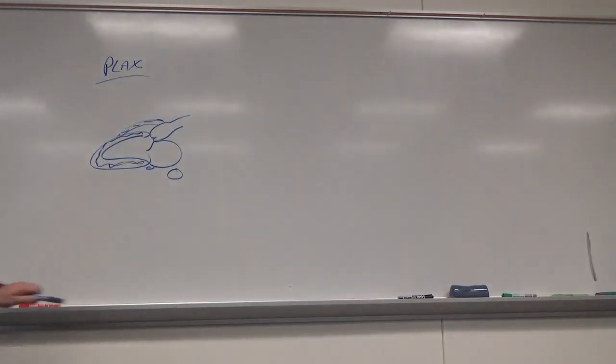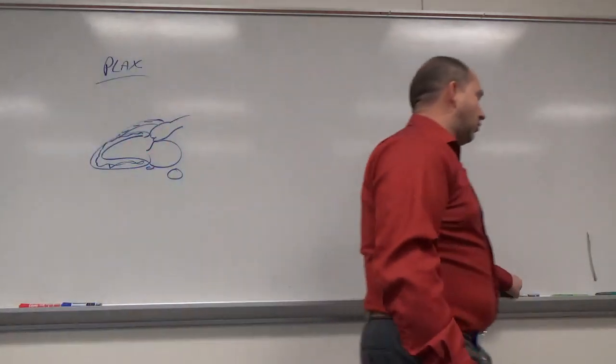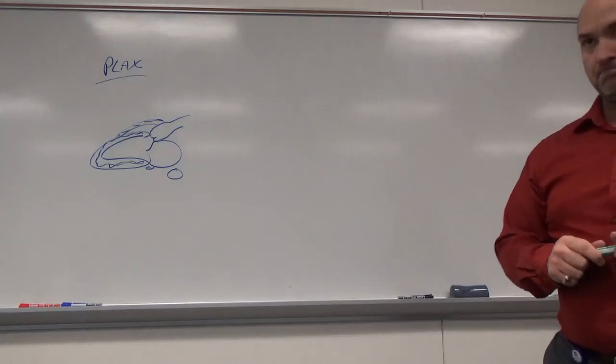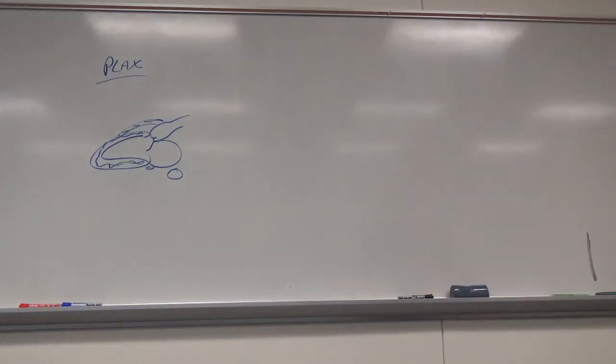So what do we want to look at in this view? What kind of things can you see on this image that you would think might be of interest to us? Wall function. Yes, absolutely. So we want to see how well does it thicken. A heart that doesn't thicken is not a very effective heart. Okay, so thickening of the wall is important. What else?